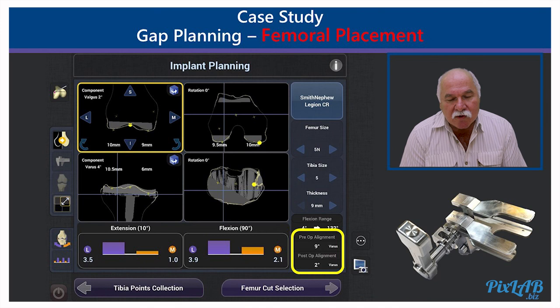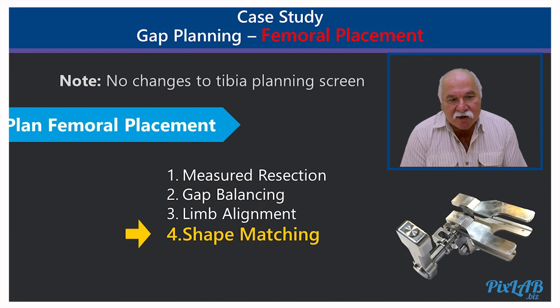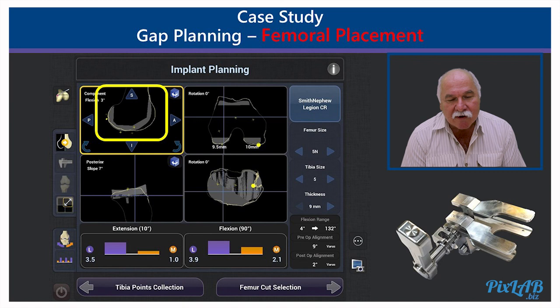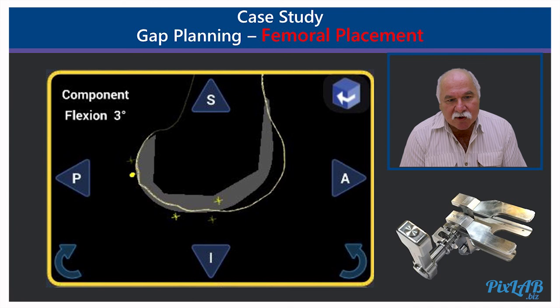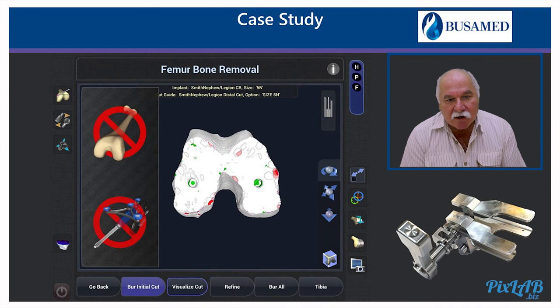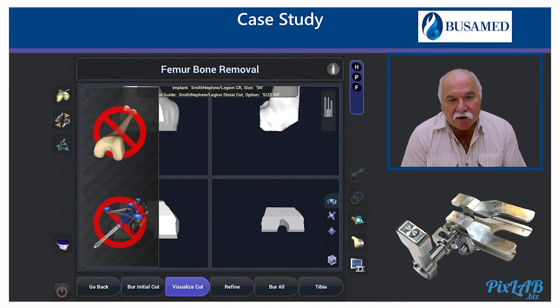For limb alignment, we started with 9 degrees of varus dynamically and ended up planning at 2 degrees of varus, which is within our acceptable range. For shape matching, the posterior surface of the femur matches well, the distal femur matches well, superiorly it matches well, and on the sagittal view it is also matching well. We have ticked all the boxes and are ready for our femoral cut.